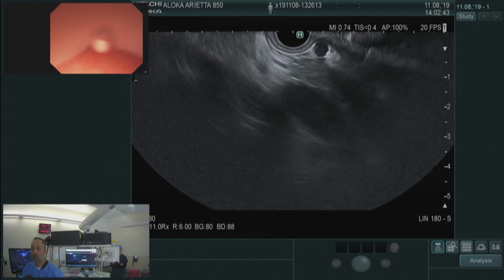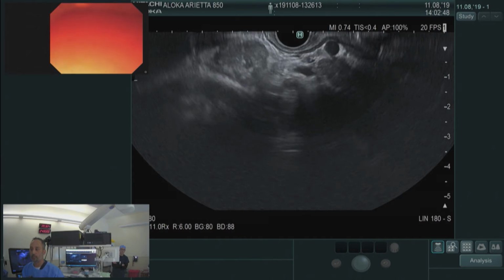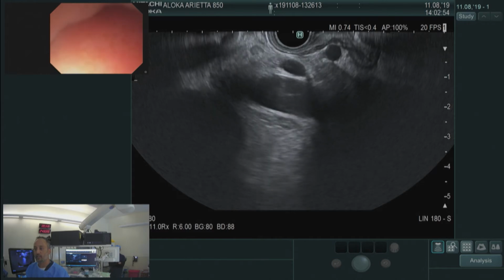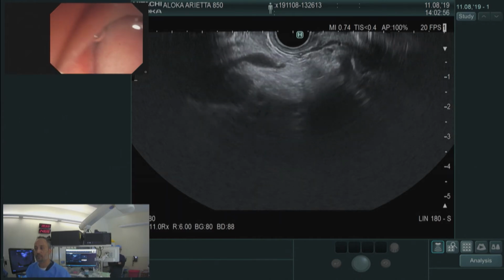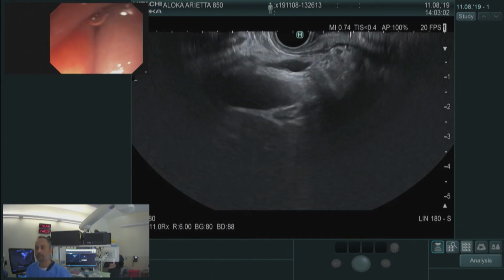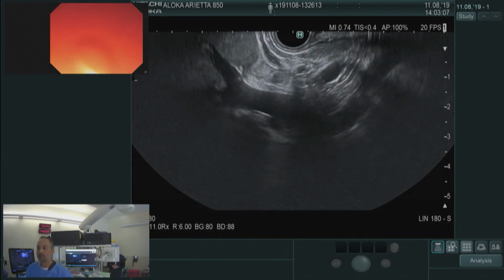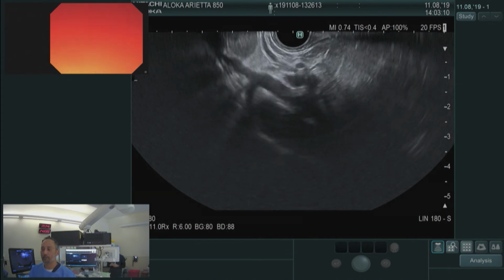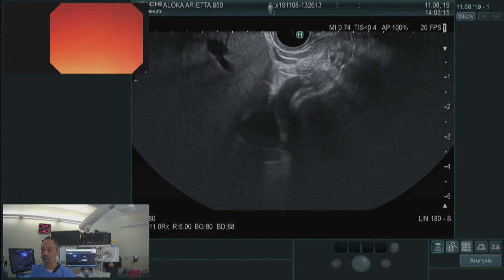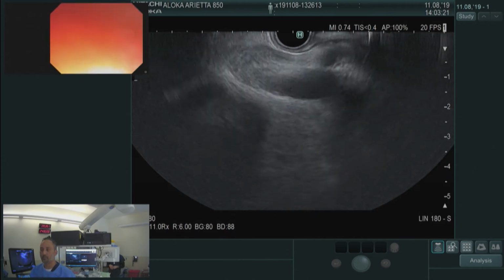Again, as we swivel back and forth, we can kind of follow it down. You can see it almost narrows as it enters the neck of the pancreas there, but we get a pretty good look, and we don't see any sludge in the duct to suggest any problems there. Okay, almost maybe something there as we're coming up. But I don't think that's actually intraductal there. And then as we come up towards the liver hilum, we can follow it up. And as Dr. Minoller described, looking to see if we can find the common hepatic duct and where the cystic duct takeoff arises from. A little bit difficult in him in this bulb view. See a lymph node here as well, inflammatory lymph node, which he has a right to have.